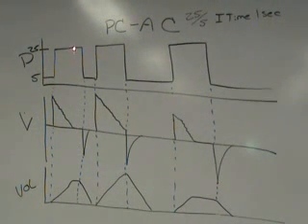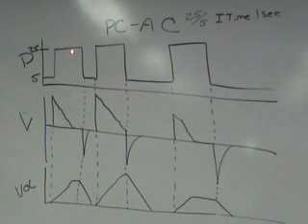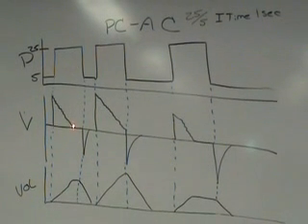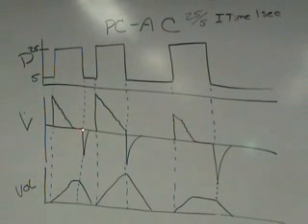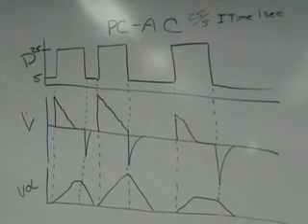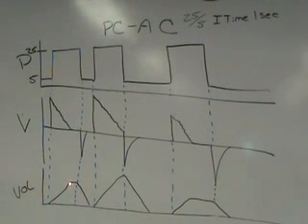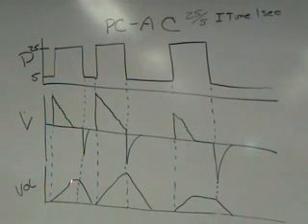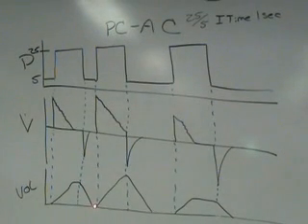So I know at this point, my lungs are at the same pressure that my ventilator is set at. So my alveolar pressure right here is 25. And that's why there's no flow going in anymore. The flow rate stays at 0 until the end of the I time, and then the patient exhales. If I look down here, I see that the volume went in. All the volume that was going to go in went in at this point when the flow rate zeroed, stayed in until the end of the I time, and then the volume came back out.